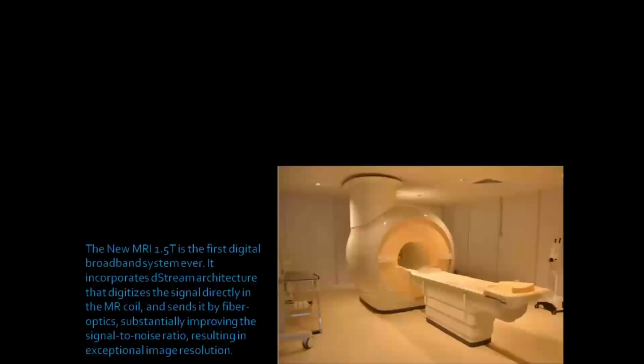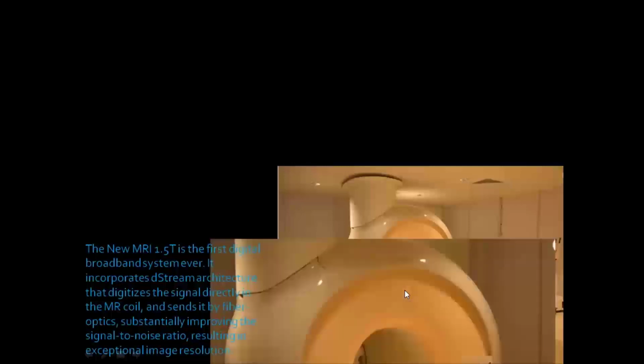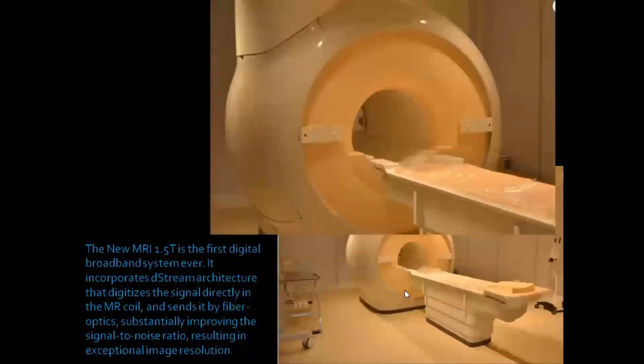So this is an MRI 1.5 Tesla, and this is the new machine that we use nowadays. It's a digital broadband system. It's very fast, with high signal to noise ratio, and gives high resolution. The only problem with this machine is that 5% of the population are claustrophobic, but this new machine actually has a 70 centimeter bore, which is really wide. It's wider than previous old scanners.